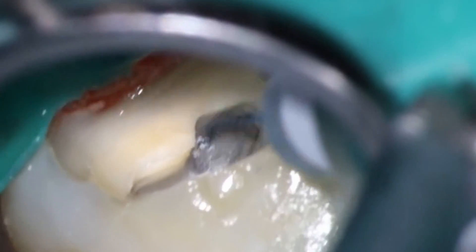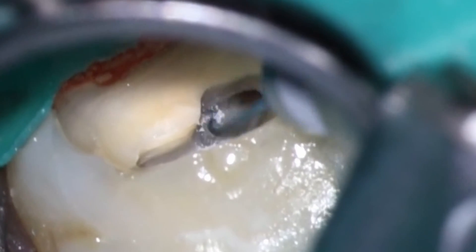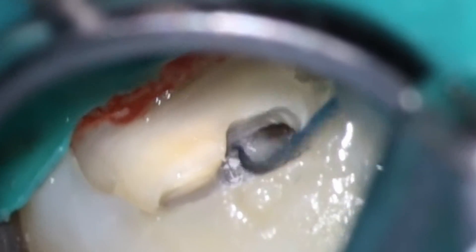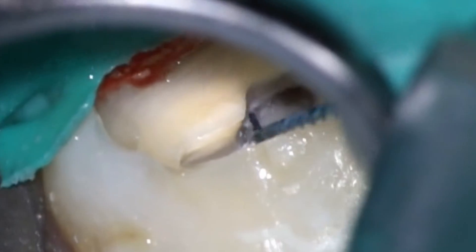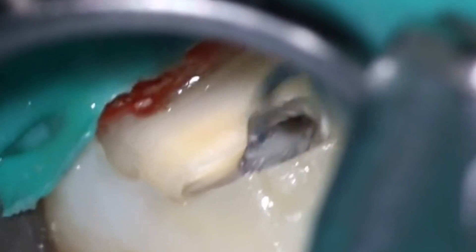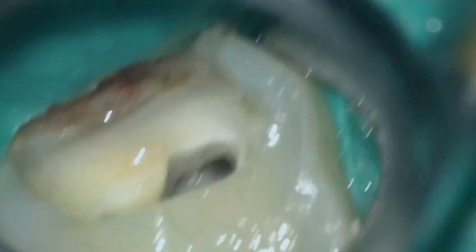Oftentimes the rotary files are going to be a better option here. K files, C files, any of the hand files condense debris apically and can ledge you out. Rotary files, on the other hand, when they're spinning, they are pulling debris up. There's the trick of using the palatal canal — which is straight — to heat up that file and make it a little more stiff. As you can see, it's buckling pretty quickly, and the pressure I'm putting in is very, very light. You don't want to break a pencil tip — that's kind of the amount of pressure you want.